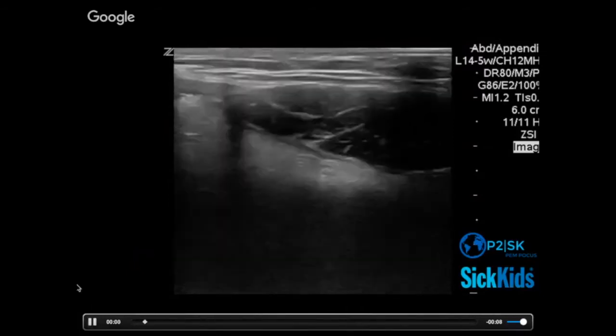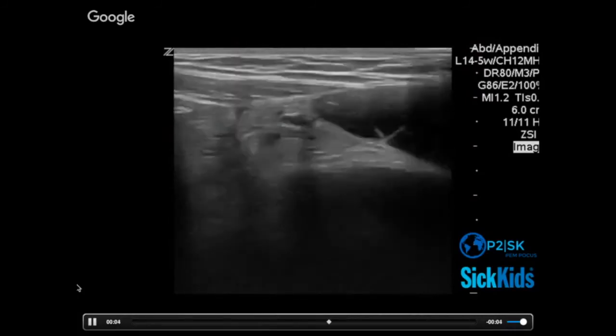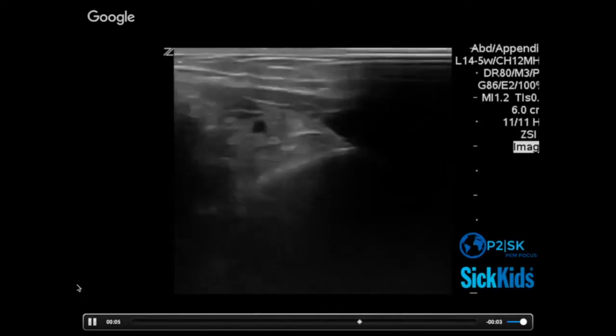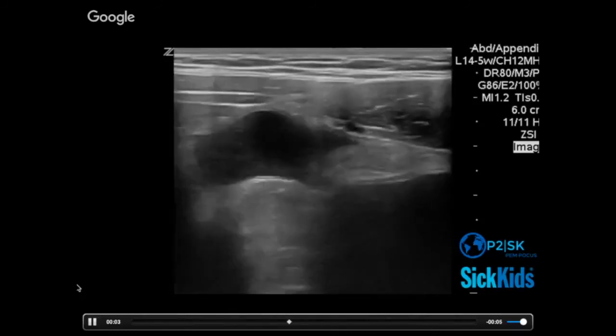Is this a low risk or a high risk exam? Right. So this is a lot of the thinking about how we're going to use right lower quadrant ultrasound as emergency physicians. It's not as a definitive comprehensive radiology test, but as part of the thing we're doing all the time, which is risk stratifying patients.